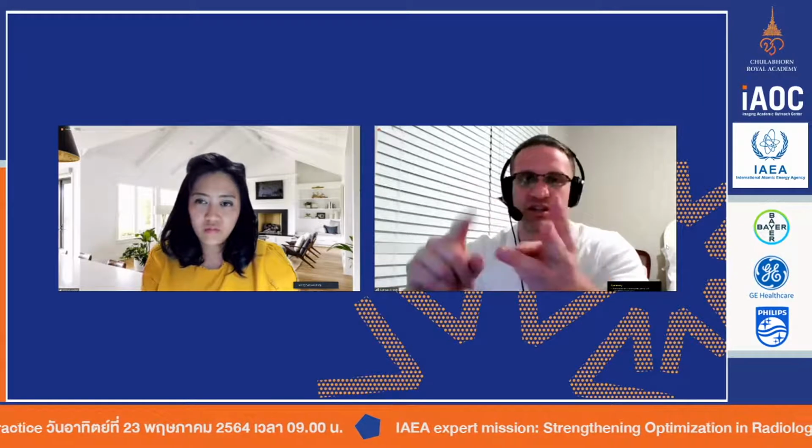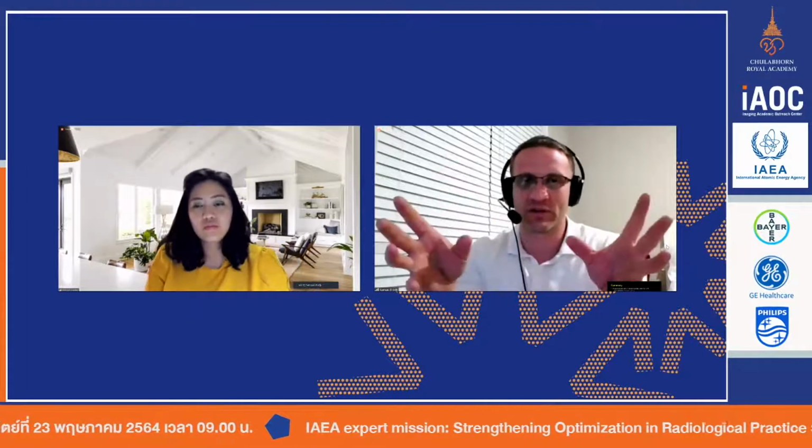So let's say you have 2 or 3 at the hospital or whatever imaging site you have there in the region. And you can look at Sectra, Philips, GE, Siemens, Hologic. You have all of these vendors and you should do some kind of annual dose calculation. In the US, it's required by law. So we have to do this annually. Every one of our systems, we have to calculate it.